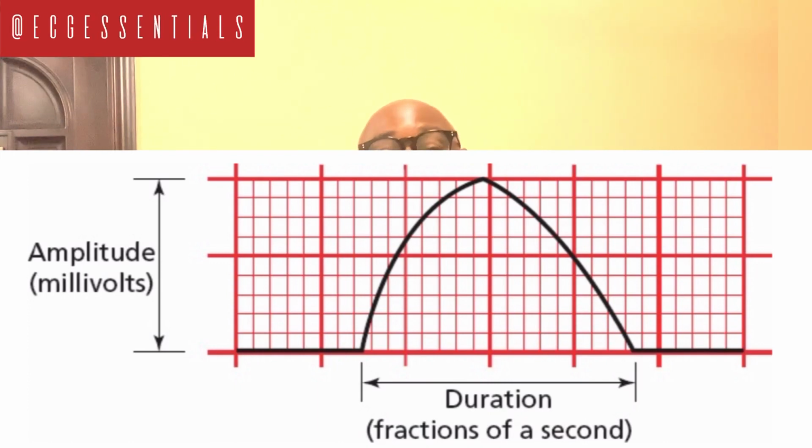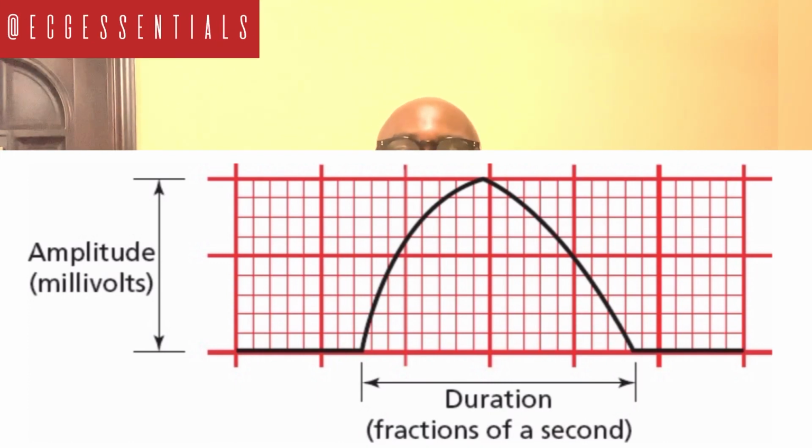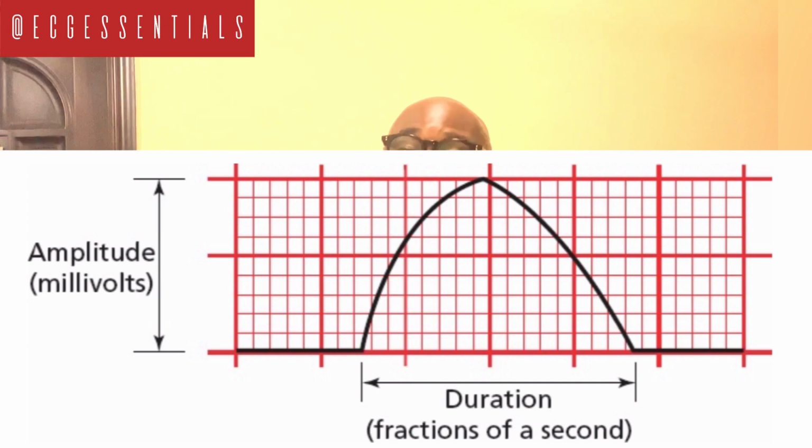So we see that these images just show how a standard ECG paper looks, and some of the information we find detailed on these papers. So let's all go through together by revisiting these images. And we realize outrightly that this ECG paper is just a roll of graph paper, just like we were using back in high school. And like those graph papers, it has a vertical axis and a horizontal axis.